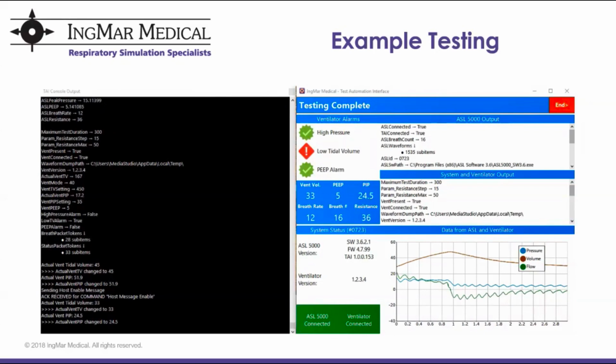It looks like we have a follow-up question here from Stefan. This one is asking, is there a way to send a command to all ASLs at once, or does each ASL need to be commanded individually?